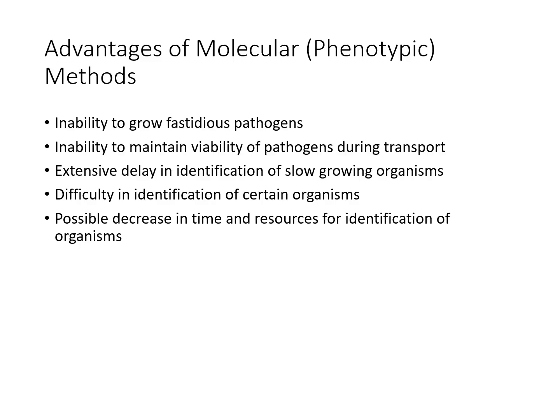It can do direct detection, so it can detect pathogens directly from clinical specimens. There is no need for viability, like mentioned earlier. That is useful for organisms that are difficult or slow to culture. There is high throughput, so it can test for multiple targets simultaneously.